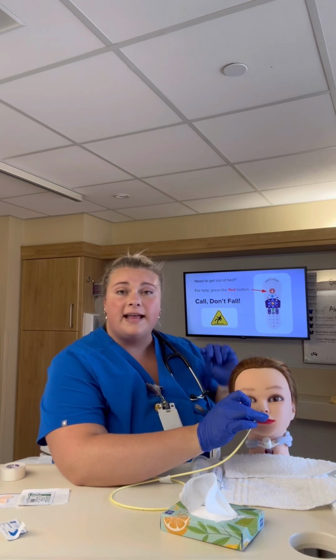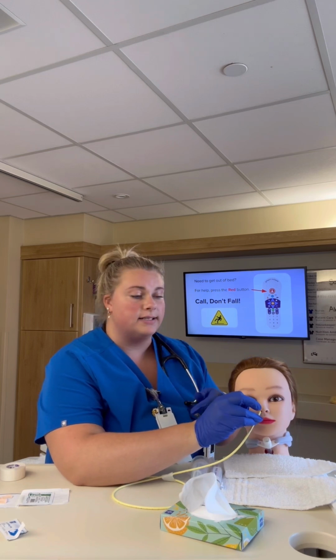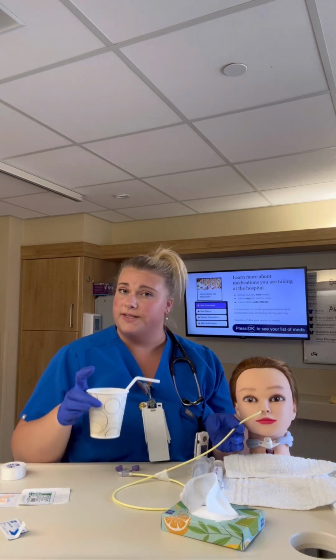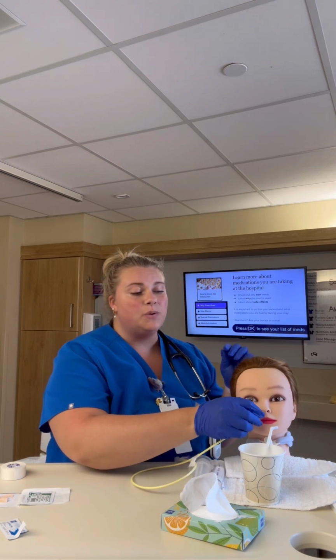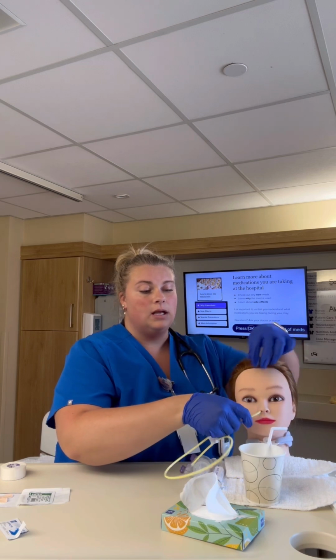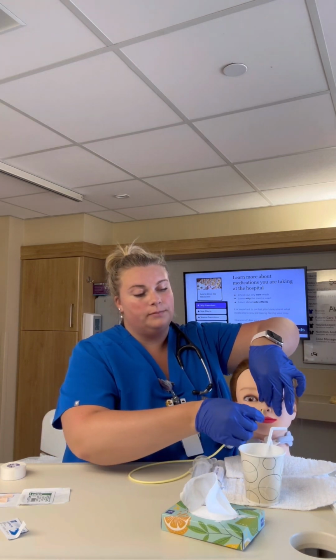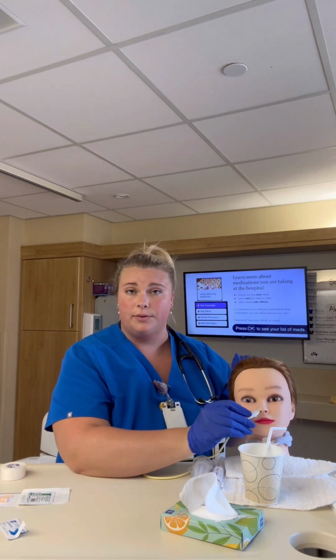Now, I'm at the point where I have reached just above the oropharynx. This is where I'm going to ask Mrs. Smith to take multiple sips of water and continue to swallow. At this point, I am going to continue to advance the tube until I reach the area on the tube which I marked with tape.